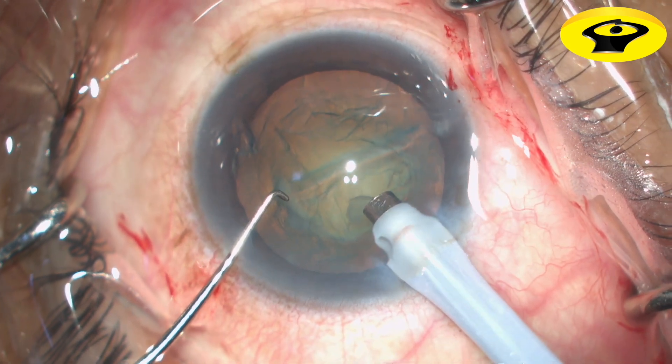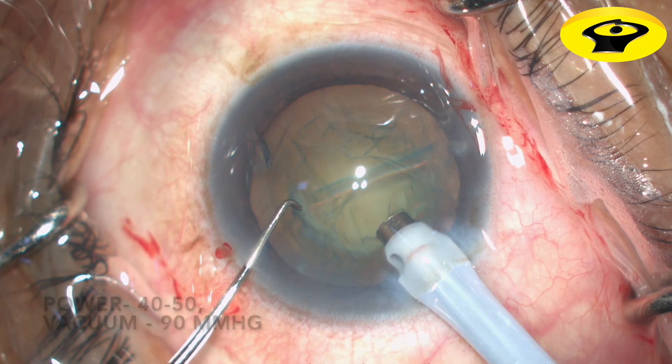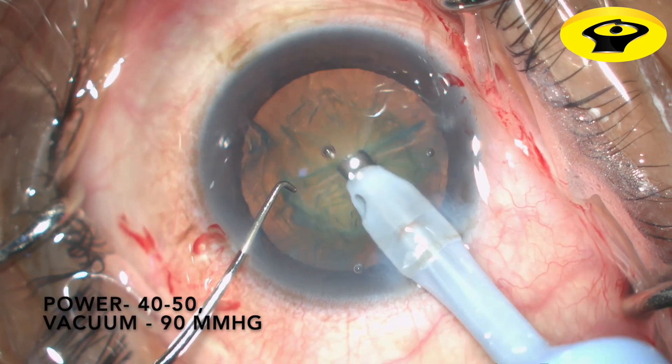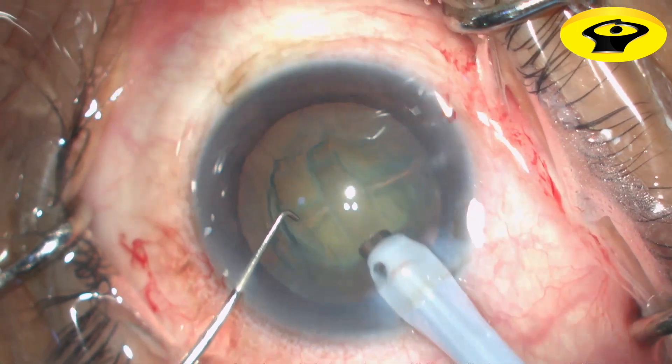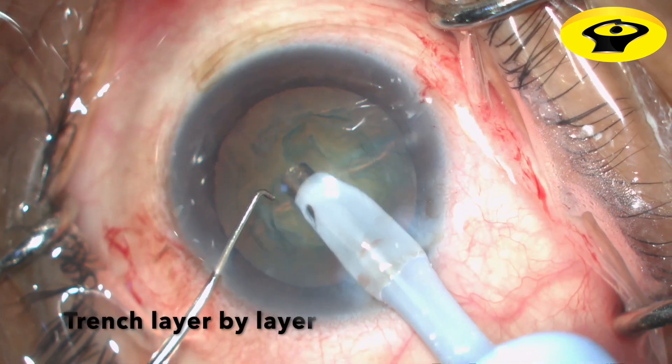Using moderate flow, low phaco power, and low vacuum, begin the sculpting of the groove. Start the groove at the proximal margin of the capsulorhexis and carry the groove across to the distal margin.